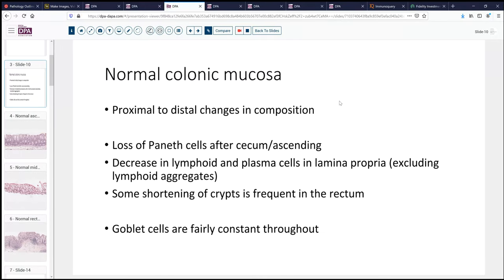It's important to understand that normal colonic mucosa has similarities but also key differences that allow one to, at least in general terms, detect whether we're proximal or more distal. Paneth cells are typically seen in the cecum and maybe ascending colon, but they're pretty well gone once you pass the ascending colon, and when seen elsewhere are an indication of some sort of abnormality. Likewise, lymphoid tissue and plasma cells in the lamina propria, aside from lymphoid aggregates, also decrease as we progress more distally in the colon. As we reach the rectum, it's very common to find some shortening of the crypts and slight architectural disarray.